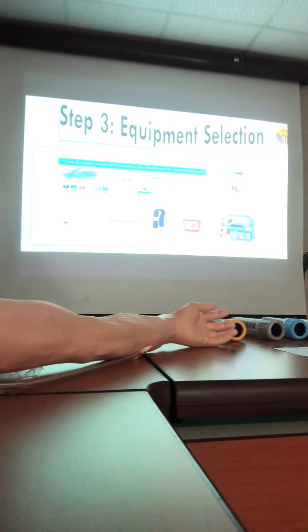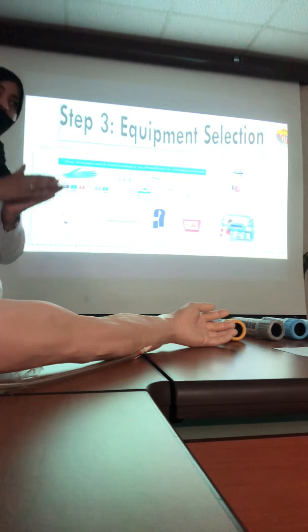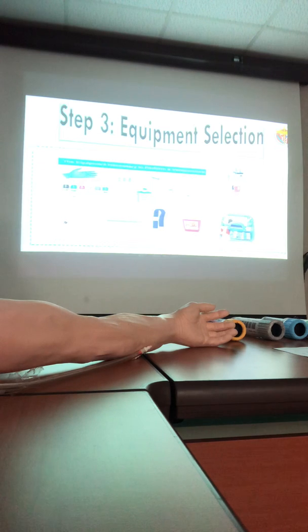I have two methods for blood extraction: closed and open system. You know what's the difference between the closed system and open system for blood extraction? The vacutainer is a closed system. Why do we call it closed? Directly from the vein to the tube. And if we extract the blood by the syringe, we remove it from the vein and then puncture it or transfer it to the tubes.